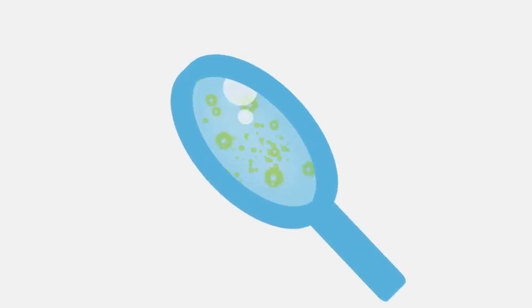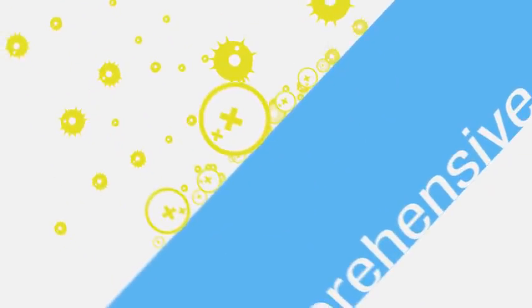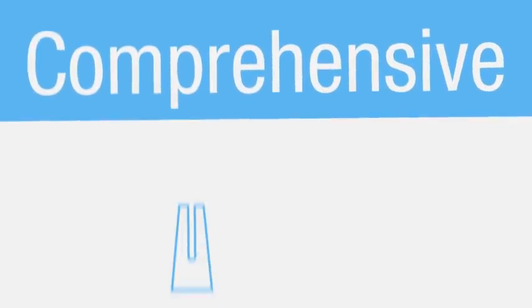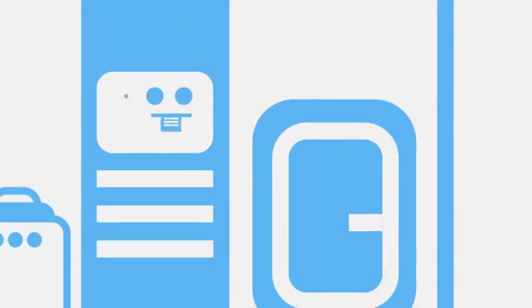We sterilize surgical instruments to get rid of pathogenic microorganisms, and since sterility cannot be seen, the only way to be confident a device is sterile is to rely on the results of a comprehensive quality assurance program. A comprehensive quality assurance program includes the use of chemical and biological indicators and physical monitors. Let's start with the physical monitors, which are the printouts, displays, and gauges on the outside of a sterilizer that you observe to verify sterilization parameters have been met.